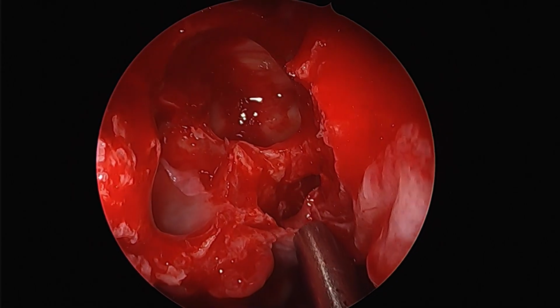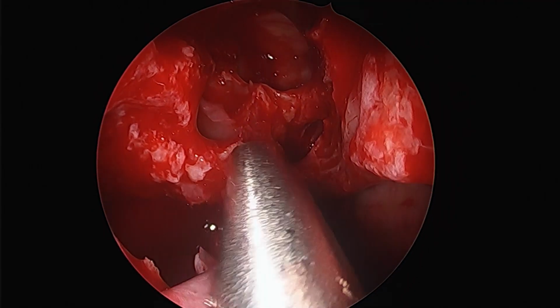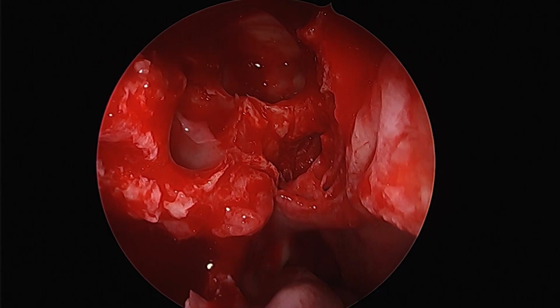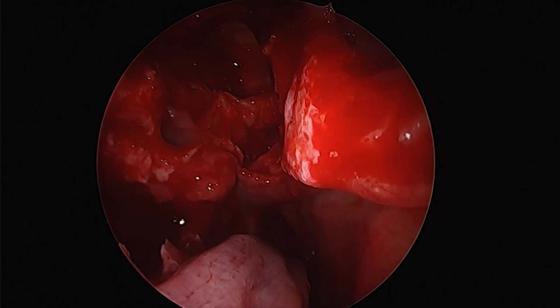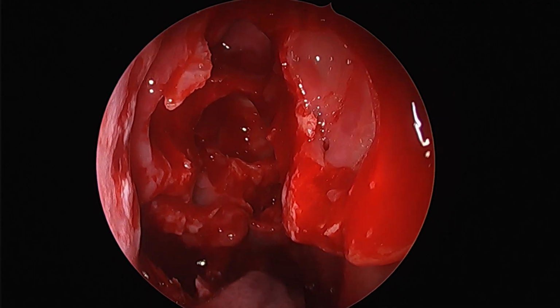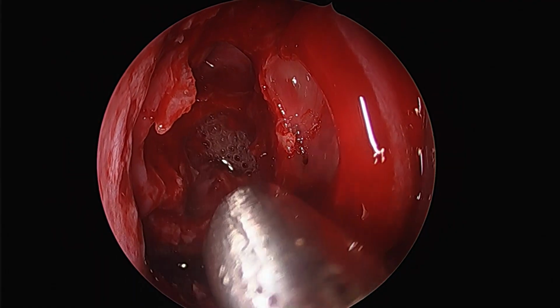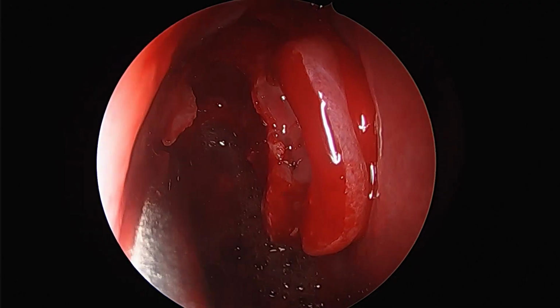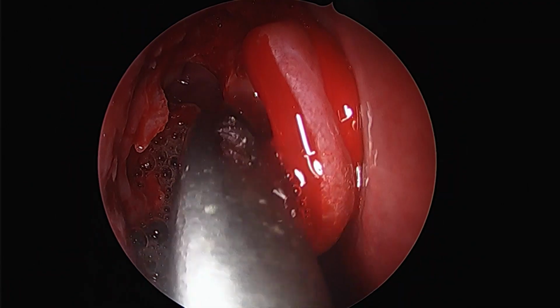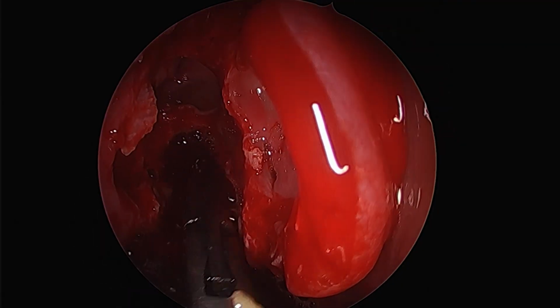As we have located the fungal ball, we can see that practically there is no polyp, no polyposis or fungal mucin, which generally would have meant that it is allergic fungal sinusitis, but in the absence of any mucin, it is difficult to call it that. It could be either the start of an allergic fungal sinusitis, or it could be an isolated fungal ball that is present in the posterior ethmoid, and if not removed, would definitely progress to go towards the orbit, the skull base, or the sphenoid sinus.